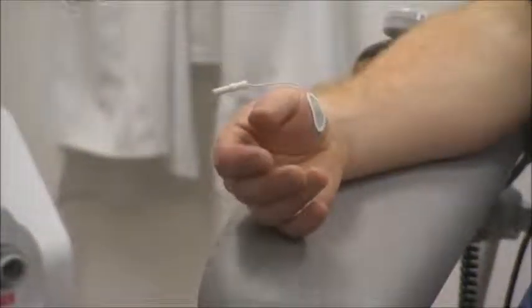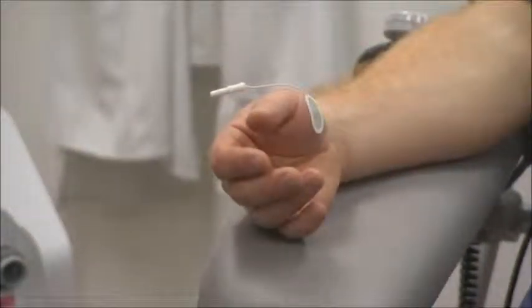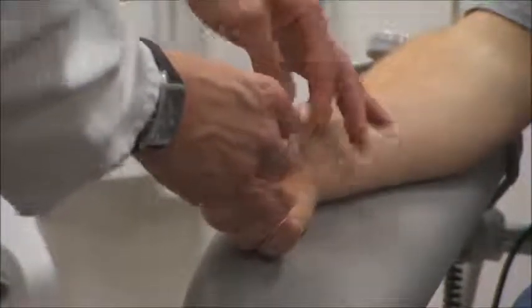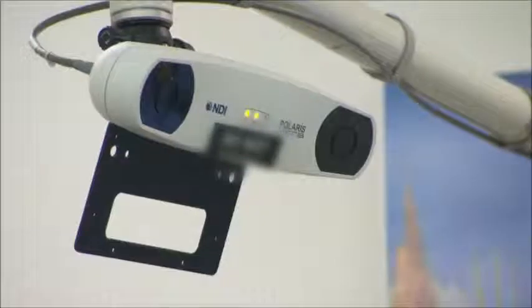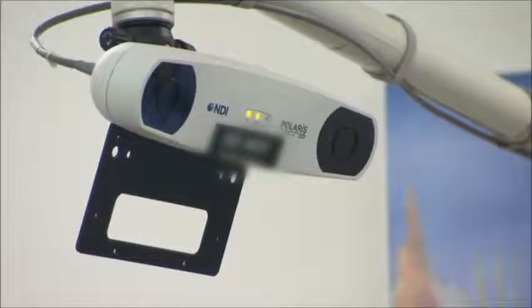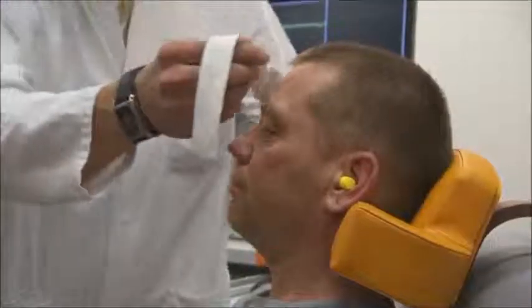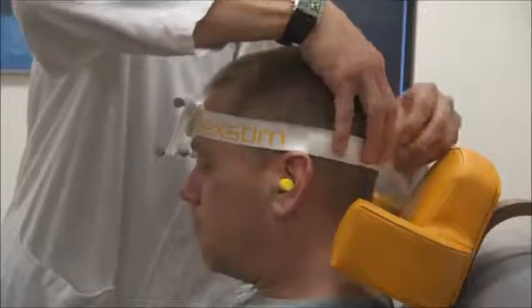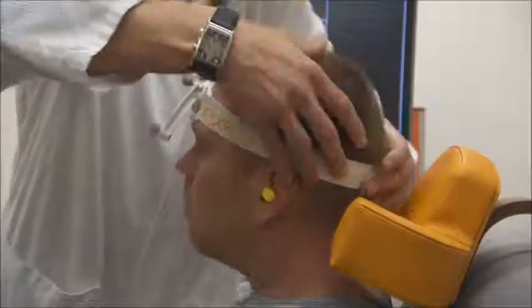TMS over the motor cortex evokes responses in the peripheral nerves. The motor-evoked potentials are measured by placing EMG electrodes over the muscles. An infrared-based tracking system is used for navigation. The head tracker, the TMS coil, and the digitizer pen are all identified by reflecting marker spheres.